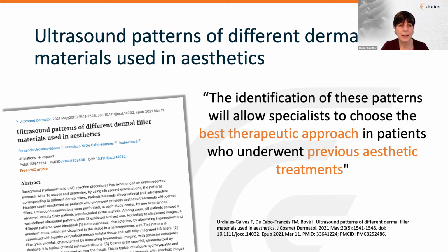The next paper is a fairly recent article, and it describes how we're able to successfully characterize dermal fillers with ultrasound. Different fillers have different distinct ultrasound characteristics, and the identification of these will allow practitioners like yourselves to choose the best therapeutic approach in patients who underwent previous aesthetic treatments.